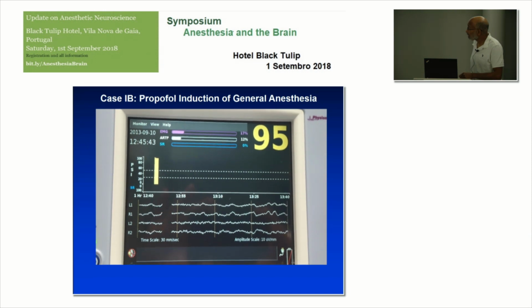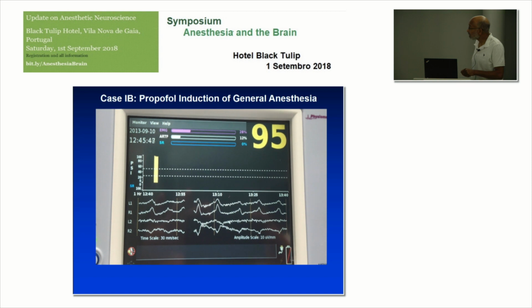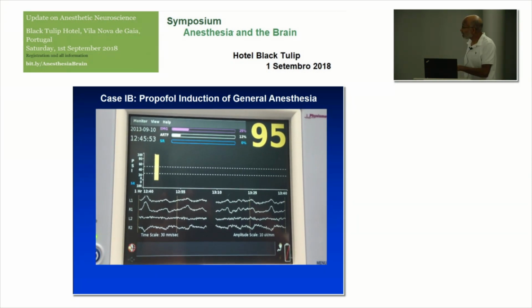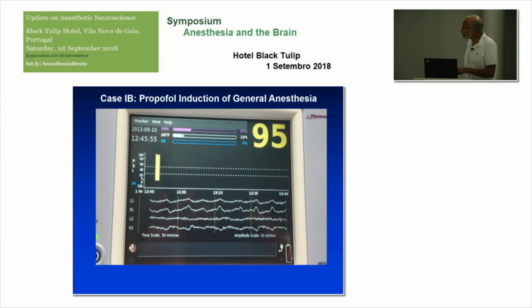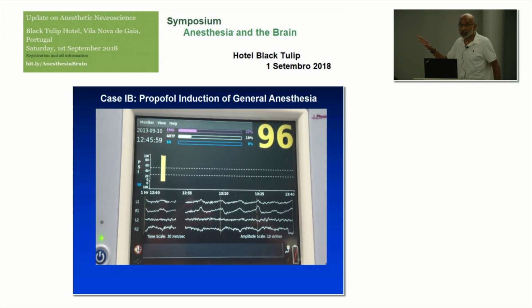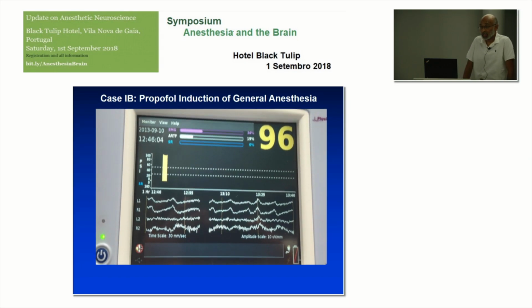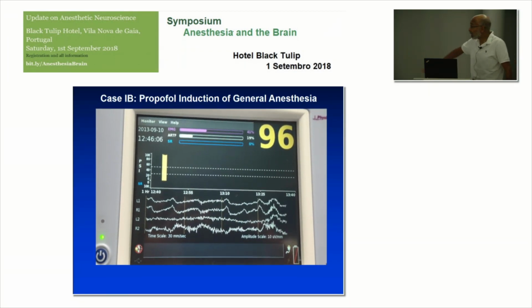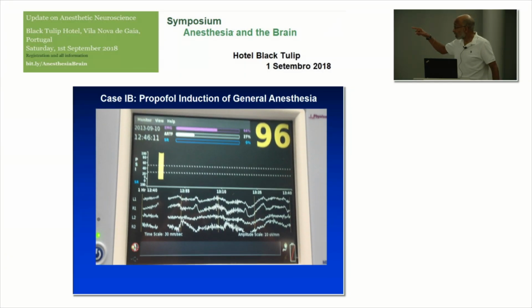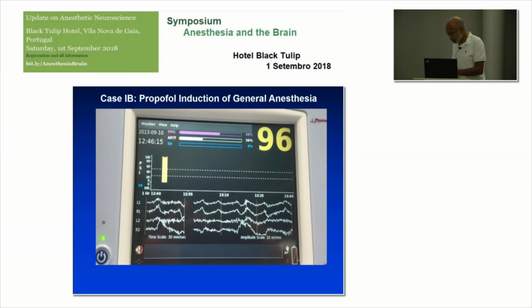So we inject the Propofol, and those are eye blinks if you haven't really paid attention to this on the EEG before. And these are 4 leads of EEG, so there are 2 on the left, 2 on the right, and then the ground and the reference are in the center, all right? And this is going to get noisy here in a second, real noisy. And that's because, as you know, when you inject Propofol, it burns like crazy when it goes in. So she's tensing up now. So that's actually going to be good from a pedagogical standpoint because you're going to see exactly when the drugs take effect, right? So just about another 6 or 8 seconds here.